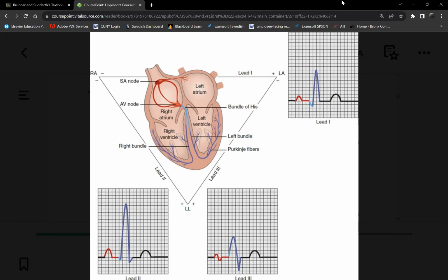All right. So when we say 12-lead ECG, which is the minimum standard in order to make a diagnosis of an abnormal heart rhythm, this is different from what you see on telemetry floors. So who works in hospitals here? All right, have you seen patients on a cardiac monitor? Yeah. Okay, so they only put 5 leads, correct? Yeah. On a portable box. So there are only 5 leads there. That is a limited view. Because it only has 5 leads, the most you'll see there is between 3 to 6 leads only, or 3 to 6 views.